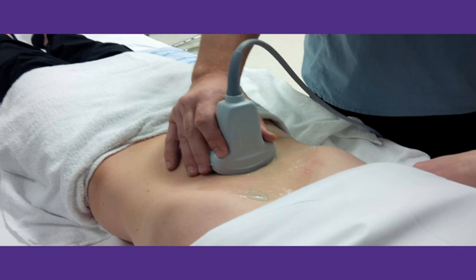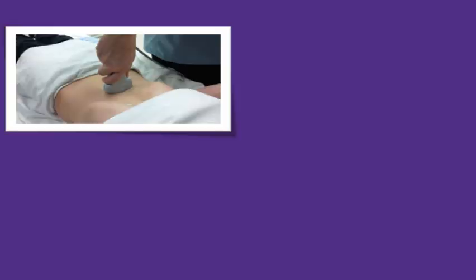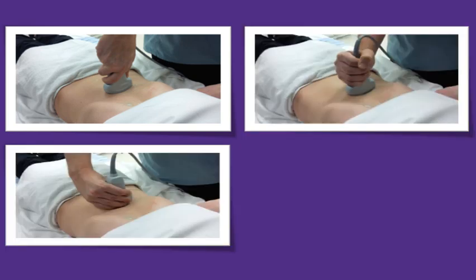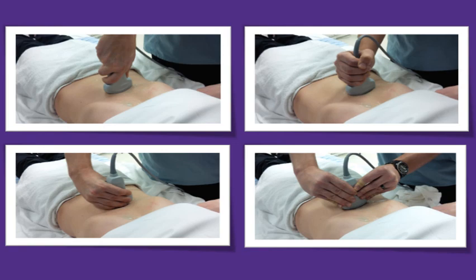With respect to technique, it is easiest to hold the curvilinear probe with your thumb and index finger, allowing your remaining fingers to rest gently on the abdomen. Holding the probe perpendicular to the skin is key in obtaining maximal resolution in this exam. Here are several examples of less than ideal technique, most of which are uncomfortable and don't allow precise movement of the probe. These should be avoided.